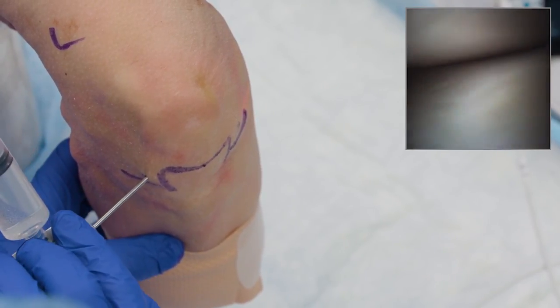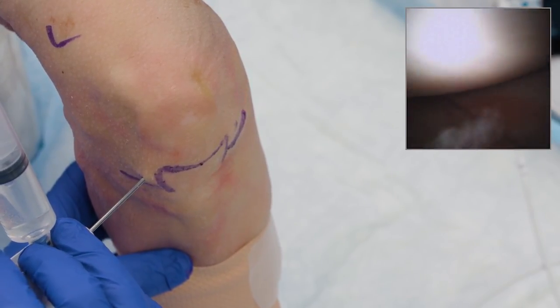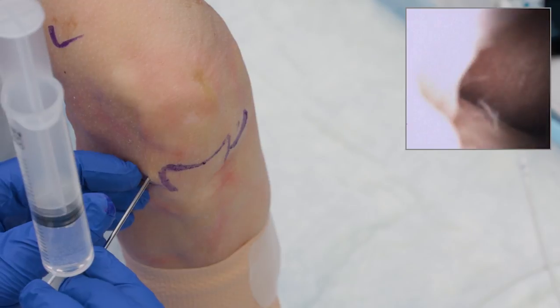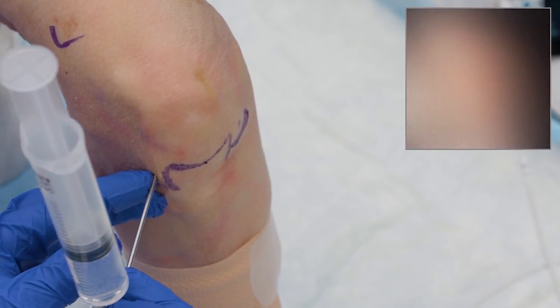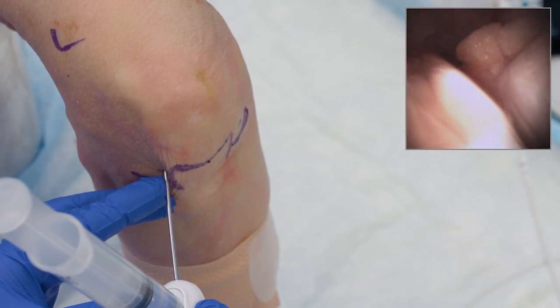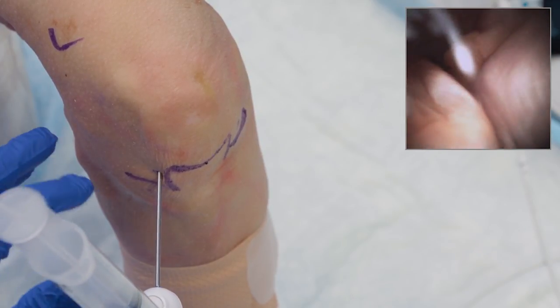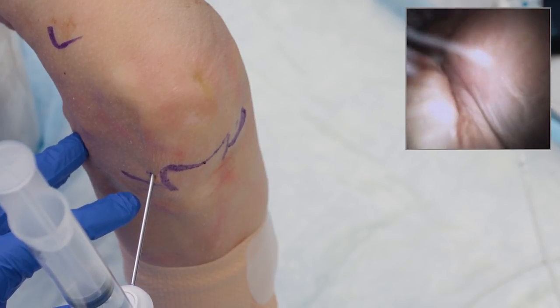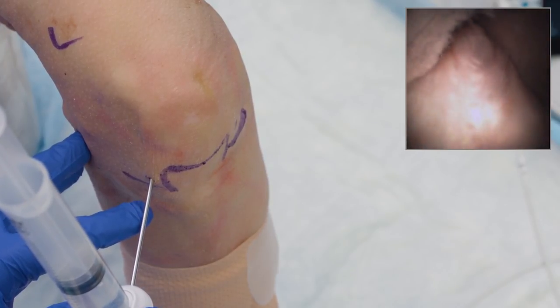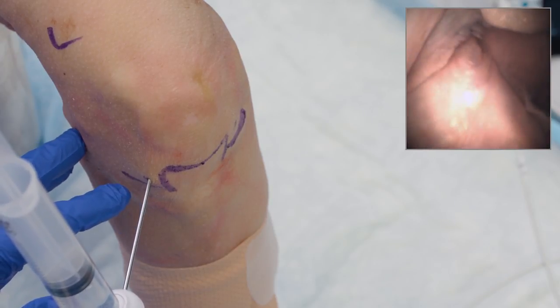Looking right into the posterior gutter — no signs of a loose body there, which is great. I'll swing back a little, let the leg return to neutral or 90 degrees of flexion, look at the cartilage one more time, then adjust my hand to swing up toward the ACL. The fat pad lies right there, so be a little careful. Without using much fluid, I'm able to see the ACL fibers really well. I can give a little flush to make them flutter. I'm looking at my PCL fibers coming down as well as my ACL. Since it's a zero-degree scope, you can switch to the medial side to watch the fibers run up and attach onto the femoral condyle.